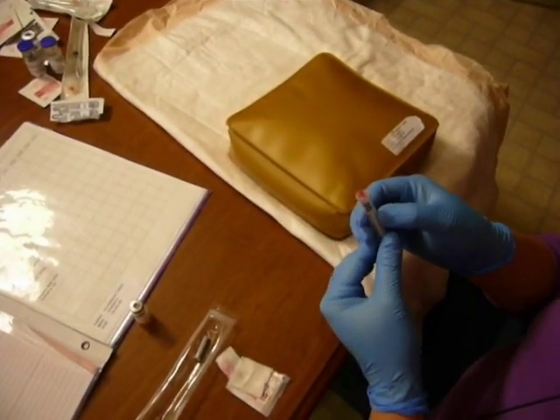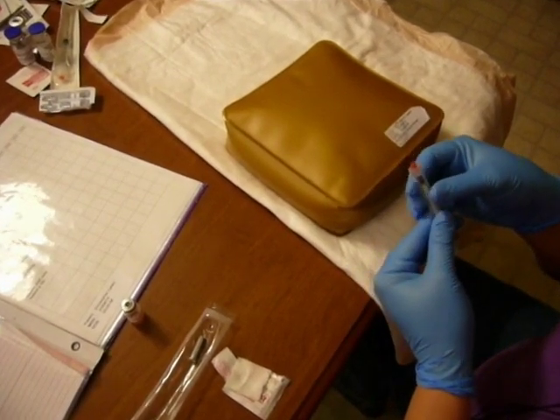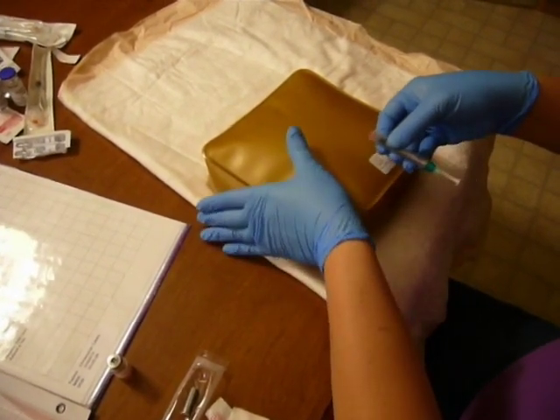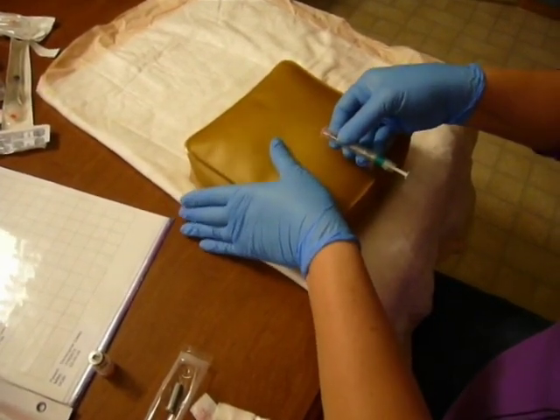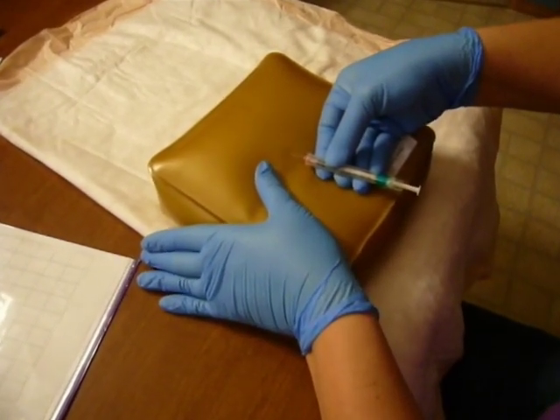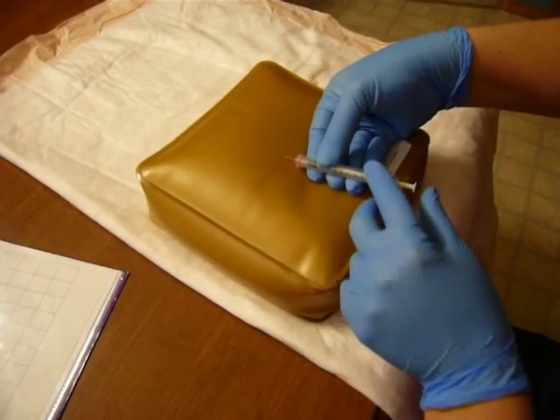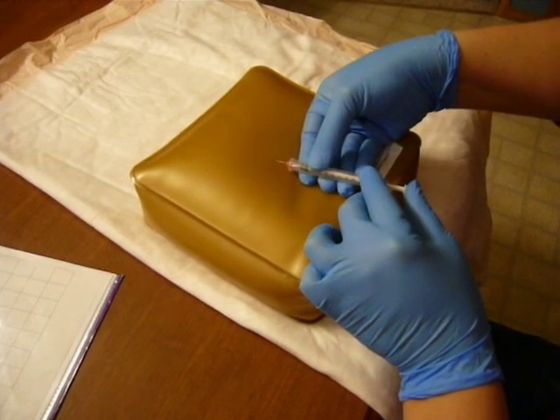Now, a few things with the intradermal injection. The important thing is that your needle bevel is up when you go in, and we're going to go in a few millimeters underneath the skin. I stabilize the needle like this with the syringe on top of my fingers, and I need to pull the skin taut on the patient's inner arm — this is my patient's inner forearm. I go right next to where I want to inject and pull nice and taut. My bevel is up. I go just under the skin with the bevel of the needle, just to cover the bevel, which is about two millimeters in. My angle is between 10 and 15 degrees. This hand is my stabilizing hand — my left hand, or my non-dominant hand — is going to come behind.